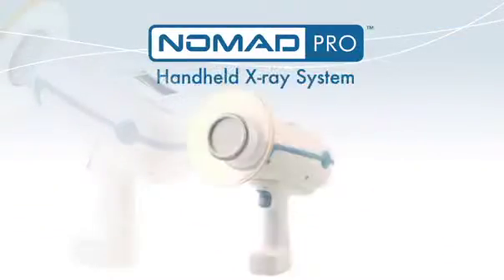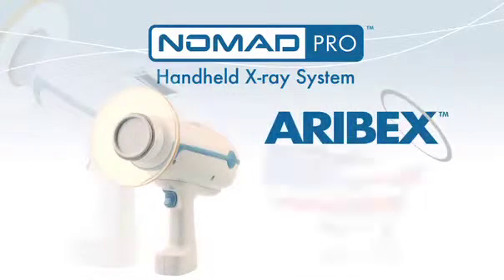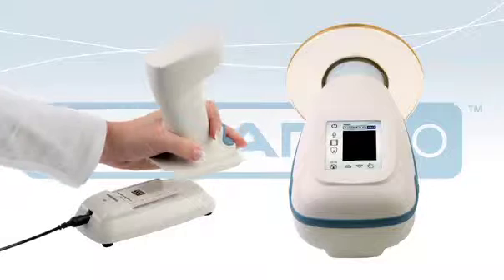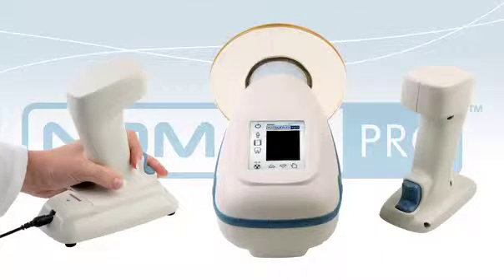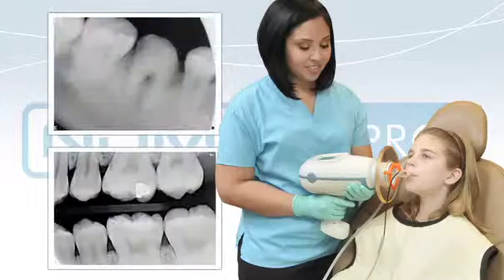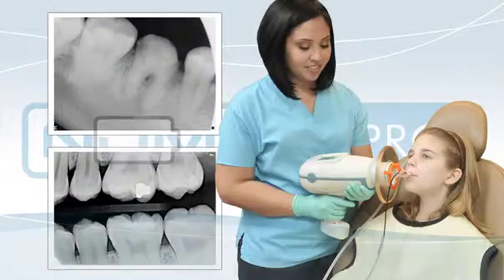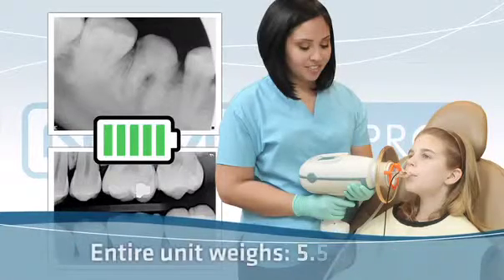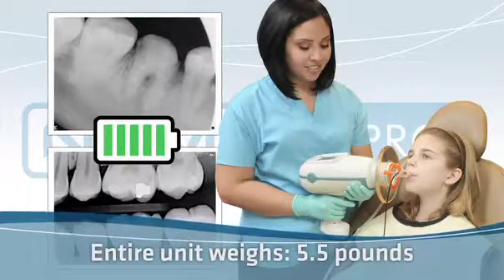Nomad Pro is the second-generation handheld intraoral x-ray by Aurebex, a US-based manufacturing company. The Nomad Pro is rechargeable and comes complete with two battery handsets and a charging cradle. Its state-of-the-art lithium polymer technology provides up to 400 exposures per battery charge, and the entire unit weighs only 5.5 pounds.